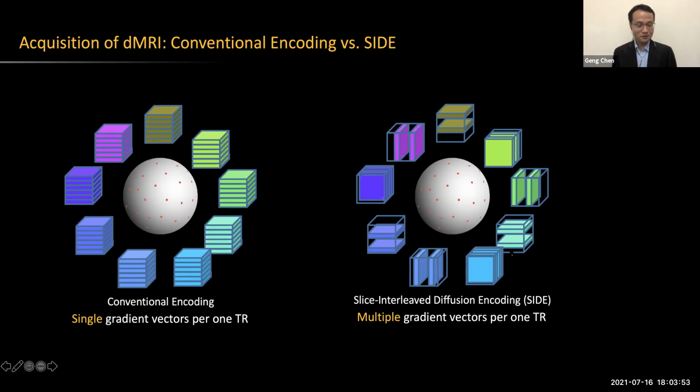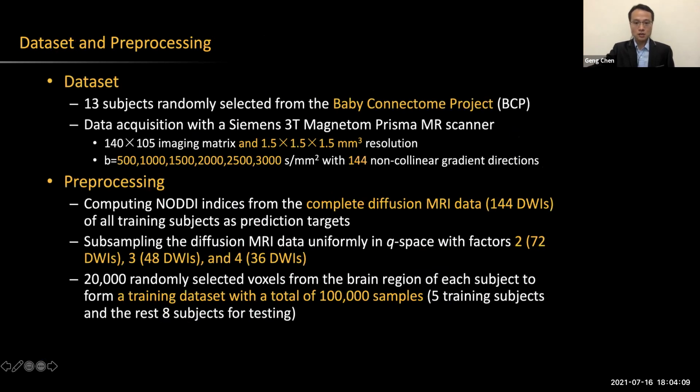Yeah, this is also a very good question, and also a real problem we are facing during the training of the model. For this microstructure work, we are actually using voxel samples. Just as I mentioned, it is more like spheres. So we use these voxel samples to do the training. Even though we have a small number of subjects, we have a lot of training samples in this case. Based on our evaluation, these samples are sufficient to train an effective model.